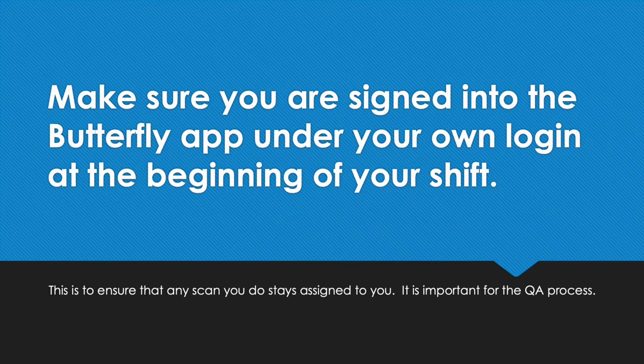It goes to our QA process, not only in-house, but to the physicians that came and did the initial class, and they will be doing a QA on the ultrasound scans themselves and get that back to us. They just want to make sure it goes back to the right provider so that they can improve their future scans, getting the right position, viewing the right anatomy, and understanding why we're doing the scan to begin with. So it's definitely important you make sure you're signed in under your app at the beginning of your shift every single time. It's just another thing to add to your list. You get there, you're checking off your truck, go ahead and log in and get that set up.